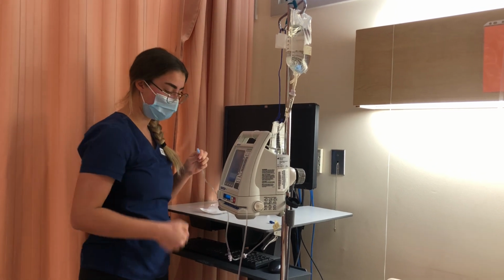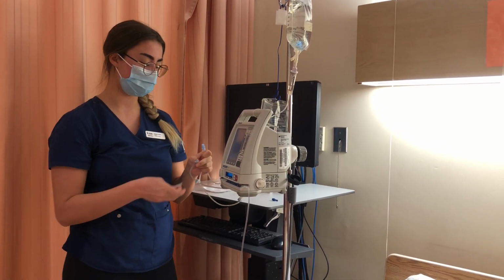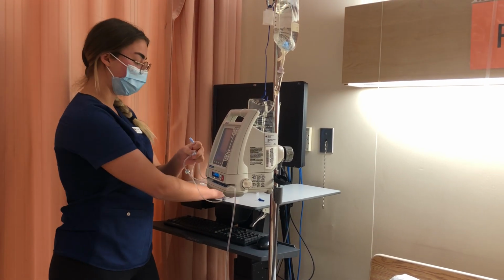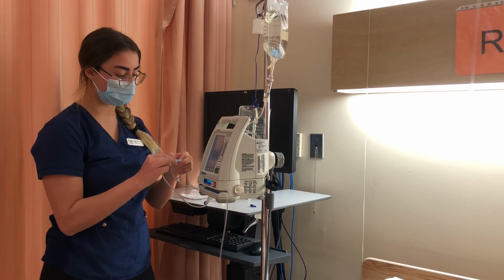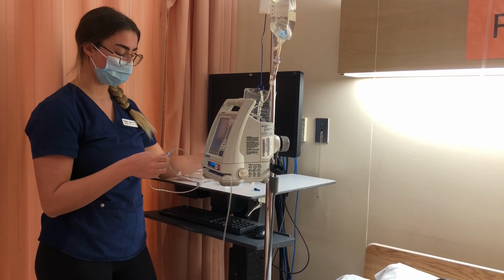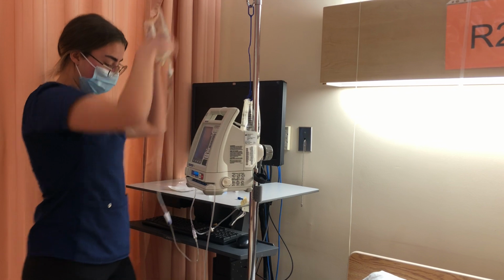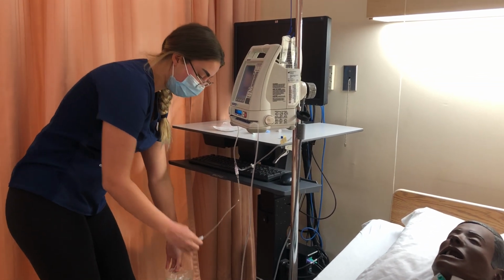So once I've done that, I'm going to pick the port above the pump so that the pump regulates the rate. So I'm going to swab for 30 seconds, let dry for 15, and then without touching the ends, I'm going to attach my secondary tubing. Or anaphylaxis. Okay, once that's attached, I can back prime my bag. So I'm going to hold it below the primary and then open my clamp.